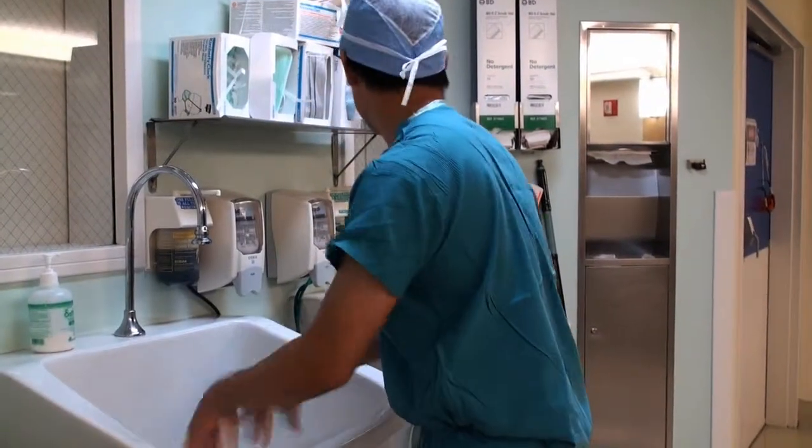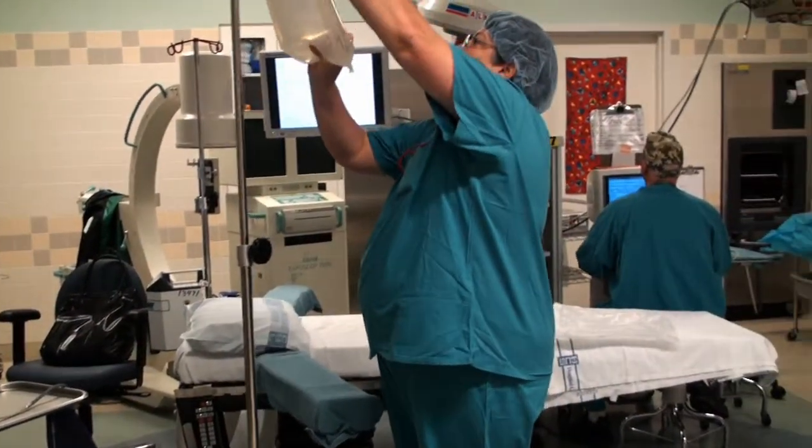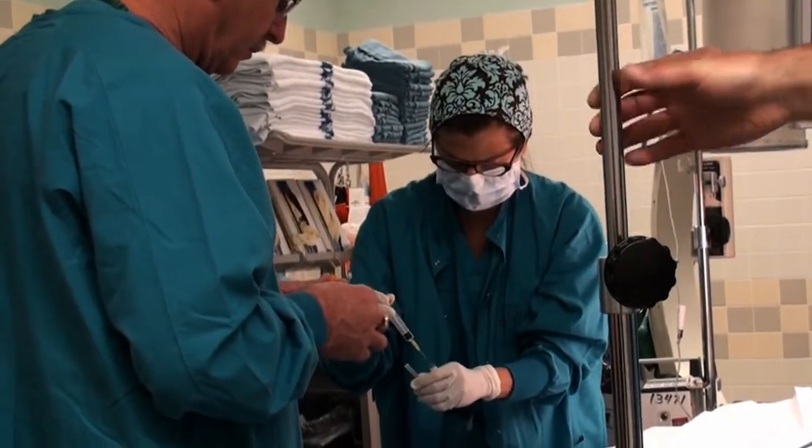A patient with early stage prostate cancer will often have the decision of whether to proceed with prostate brachytherapy or to undergo radical prostatectomy. The advantages of prostate brachytherapy are that this is a minimally invasive procedure. There's no cutting. Needles are used to place the radioactive seeds into the prostate gland. The blood loss is therefore very low or minimal. The procedure itself is short and quick. It takes about 1 hour 15 minutes for a case. The patients are not required to wear a bladder catheter after the procedure, as is the case with radical prostatectomy.